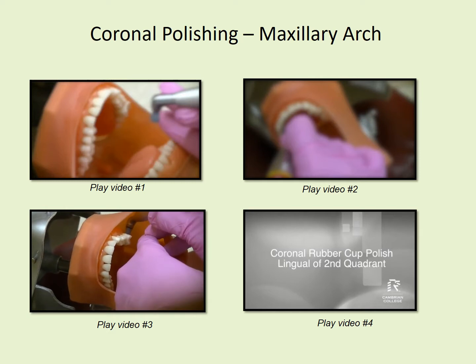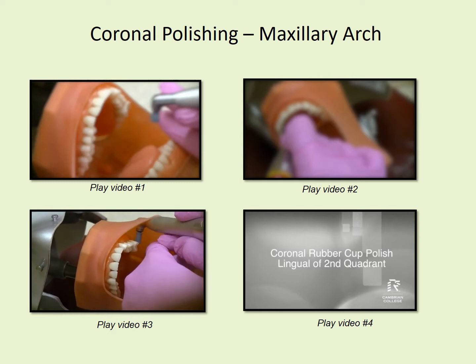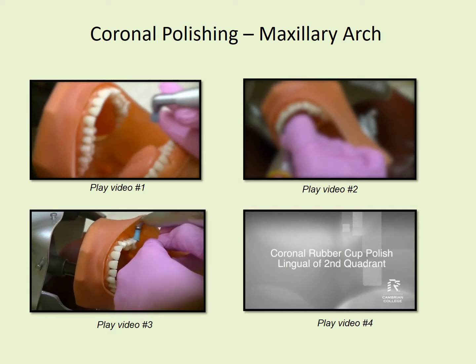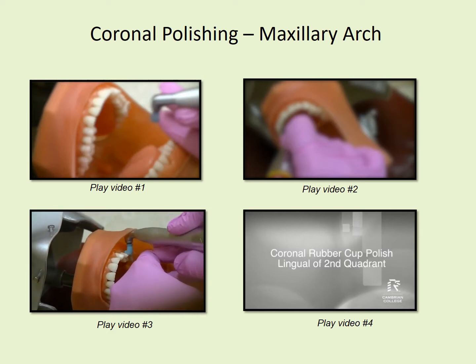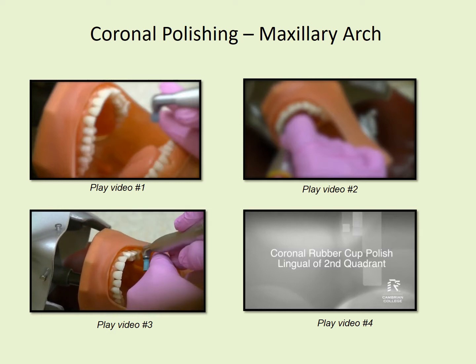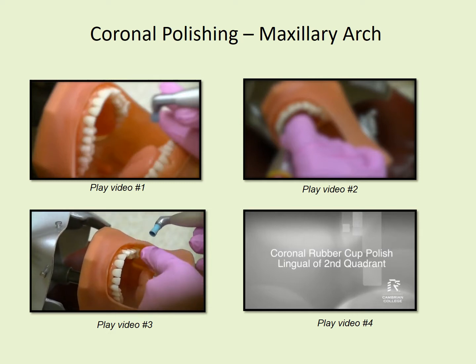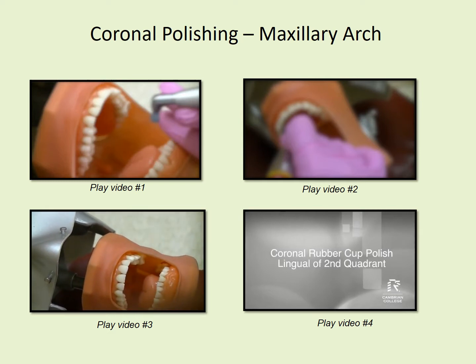Ask the client to close slightly and begin your polishing technique from the posterior, working anteriorly, and work anteriorly until you see that the lip is going to start to fall over the handpiece. At that point, you want to stop, and you would continue with the area that you weren't able to get because the lip starts to fall down. You would do that area when you come across from the anterior area at the 11 o'clock position.